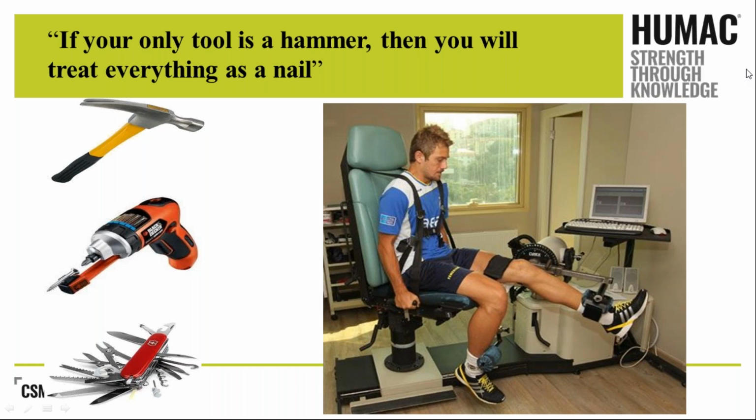Of course you can. Can you do early ACLs? Yes. Can we do some of the other types of activities? Can we do total knees, total hips, total shoulders? Of course we can. And again, the tools become important to us.